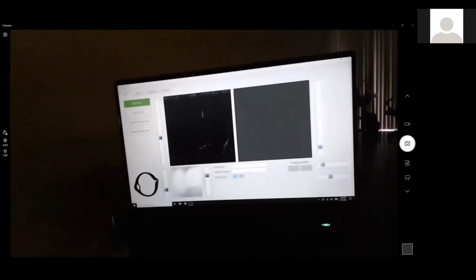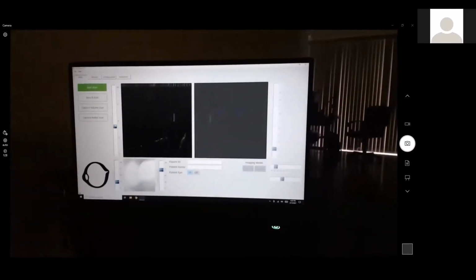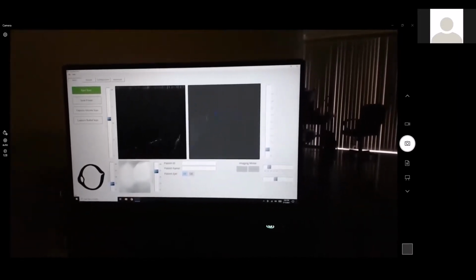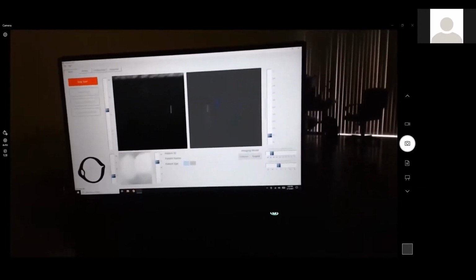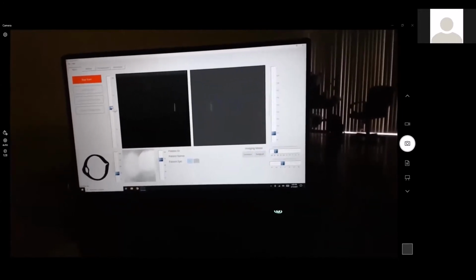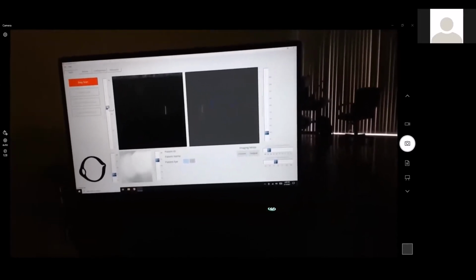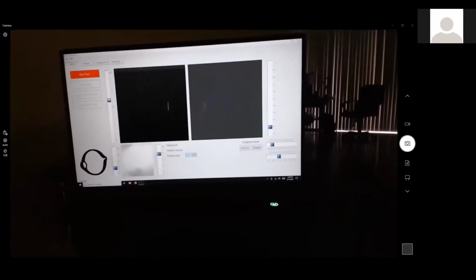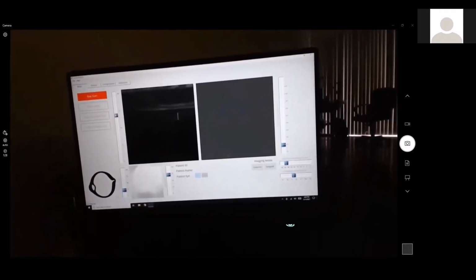So for our system, we use the same optic, but we make one change where we will actually change our focal value so it's focused on the retina. So Sean's going to turn on the focal value, change the values. In this circumstance, our focal value for cornea, it may not be relevant to you guys, is 40.1, but we're going to change our focal value to 61.1, and that then gets the retina in a better focus. And you can already see it's coming in.